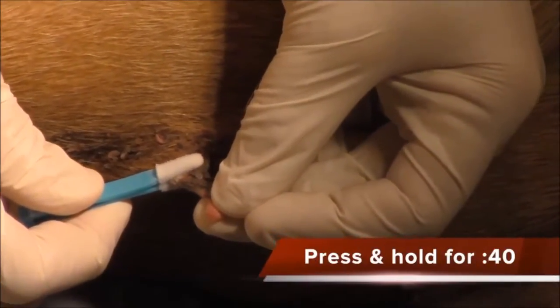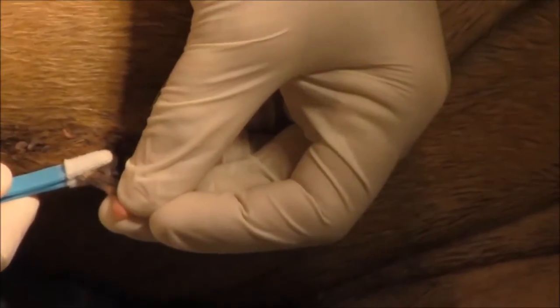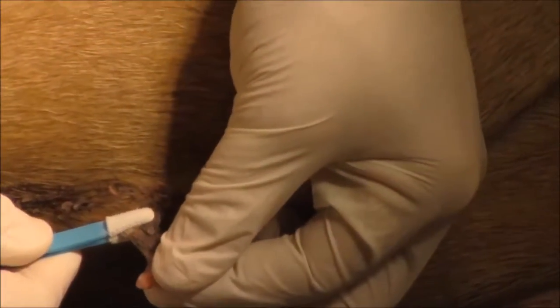We're going to hold it for 40 seconds. There's a small guide that comes with it and it kind of tells you how long to hold the tweezers or whatever instrument you use to remove a skin tag, a mole, a wart, or whatever. I just hold it on there until it freezes.